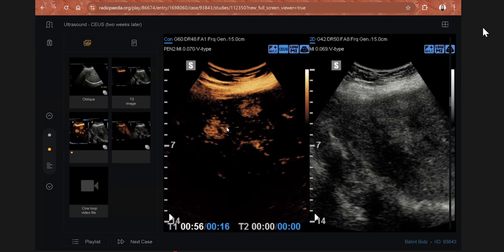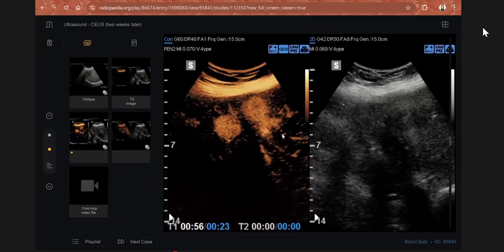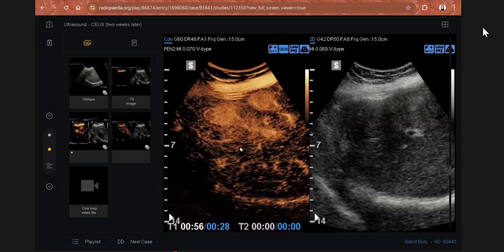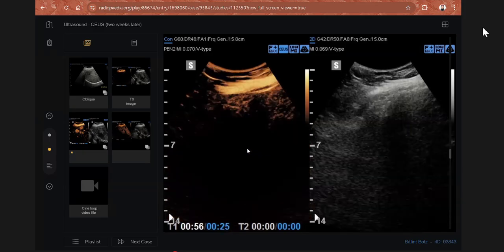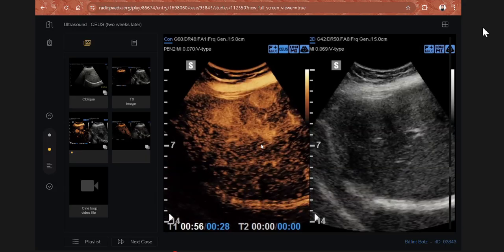First thing. Second, how you differentiate the portovenous phase is, see, the liver parenchyma is showing enhancement. So when the liver parenchyma is showing enhancement, it means the portovenous or venous phase. So this is a very easy trick. You can easily grasp the lesion. Okay, candidate 3. Yes, sir. So this can be shown. The same case was shown in my exam.